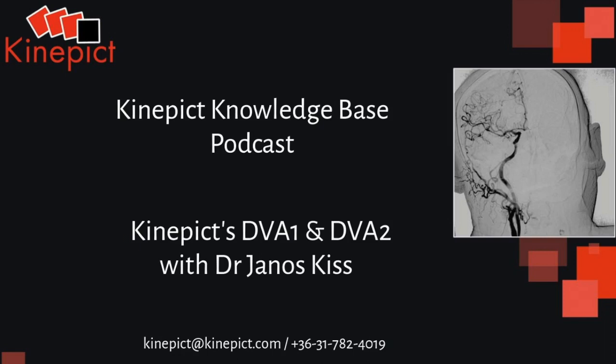How will this special algorithm be available for the end user? At the moment, the current release, which is currently 5.1, but very soon we will release the 5.2 version, DVA2 is available for everybody and for every application. But as I mentioned, what we saw was that the advantage of DVA2 can be observed mainly in the lower limb interventions, and especially in the below the knee regions, the popliteal, talocrural regions.